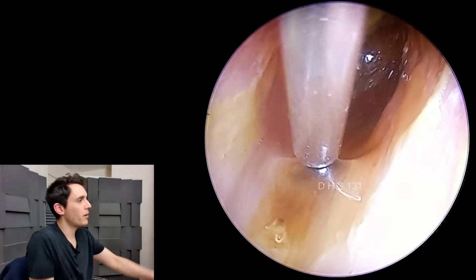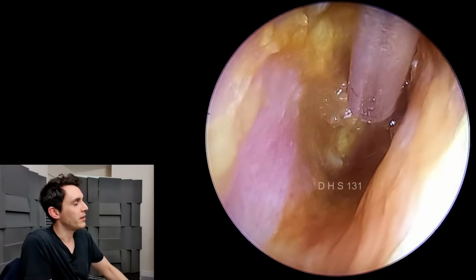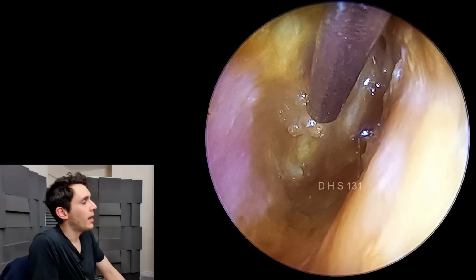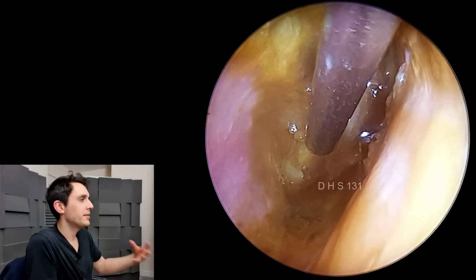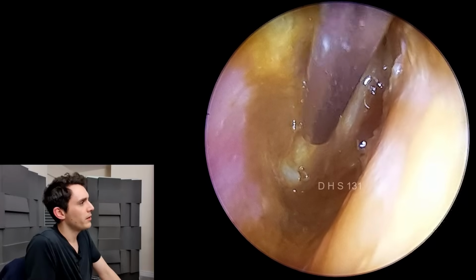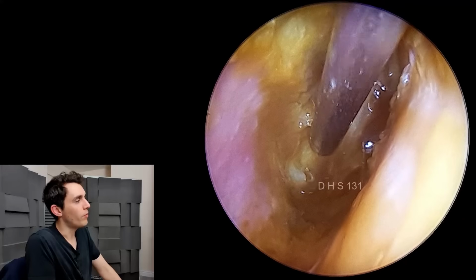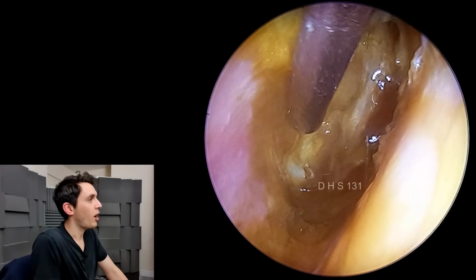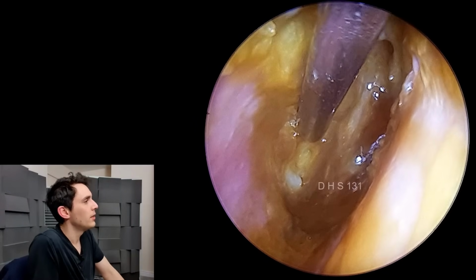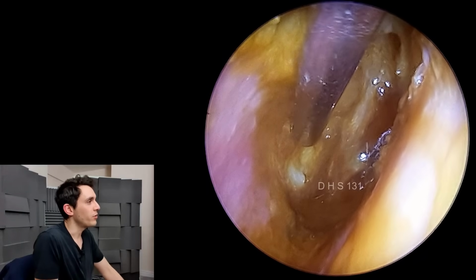So there's lots of sodium bicarb here. And at this stage I thought, well, sod it, I've got to do something to speed this along, because I was making very little progress up to now. I let the sodium bicarb sit in there for maybe a couple of minutes. It's basically a water-based drop, which releases carbon dioxide when it touches acidic material. What it's going to do is give me a little bit of purchase and help me lift the skin off this eardrum.